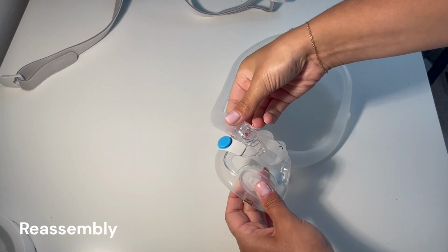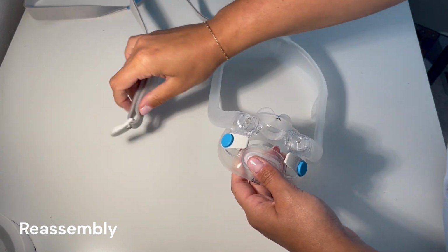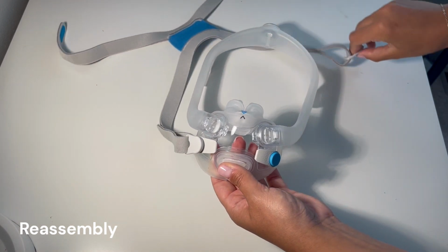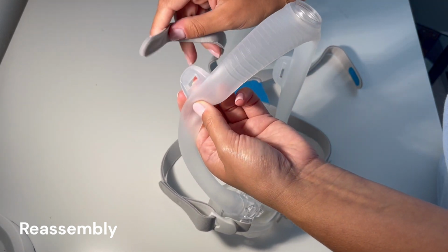To reassemble, align and insert the frame connector tab into the cushion slot and press down until it clicks. Repeat on the other side. With the ResMed logo facing outwards and up, put the lower straps on the mask and insert the upper headgear straps into the frame from the inside.